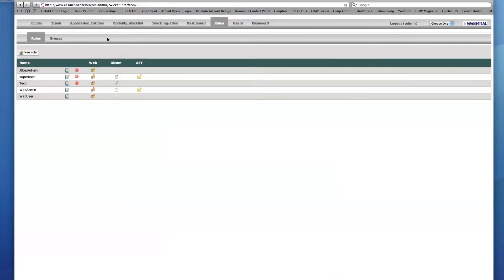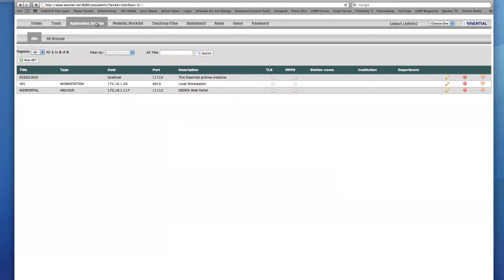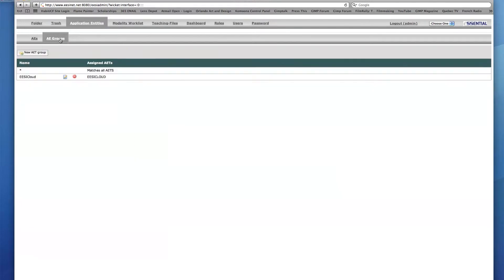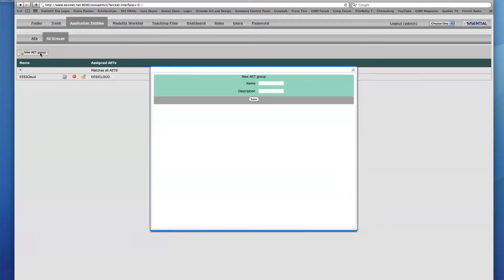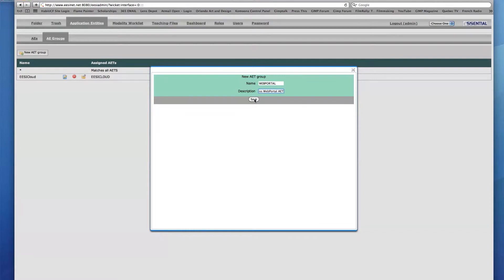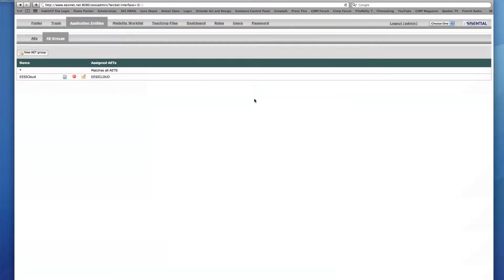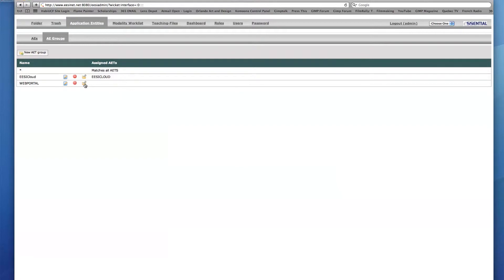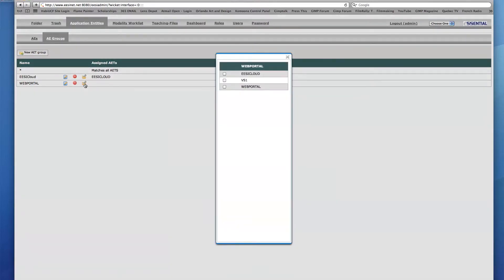To add an AET group, go into the Application Entities tab, then click on the AE Groups sub-tab. You may then add a new AET group by clicking the icon and typing in the name and description of your choice. Once the new group name appears, click the Assign AETs icon to choose which application entities are made available to users in this group.